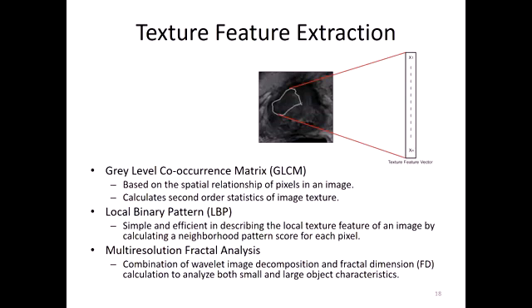So this uses 4 frequencies of wavelet to decompose the image. Then we run fractal dimension calculations on those, and detect which of the 4 is the best. We can apply the same 4 wavelets to that particular decomposition, run fractal dimension again, so we build a tree structure until we get down to where we're not getting any difference, a threshold, and then we stop there. And the way the fractal dimension cuts it down is we look at the image as a whole and then in pieces as we go down.